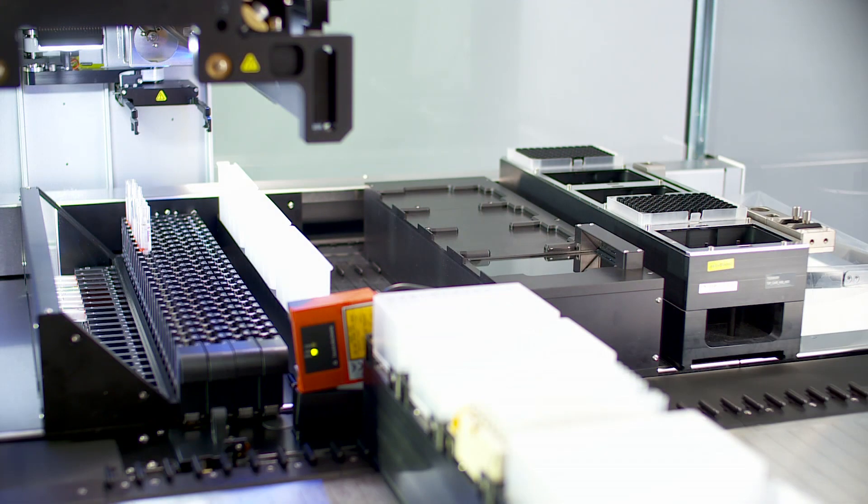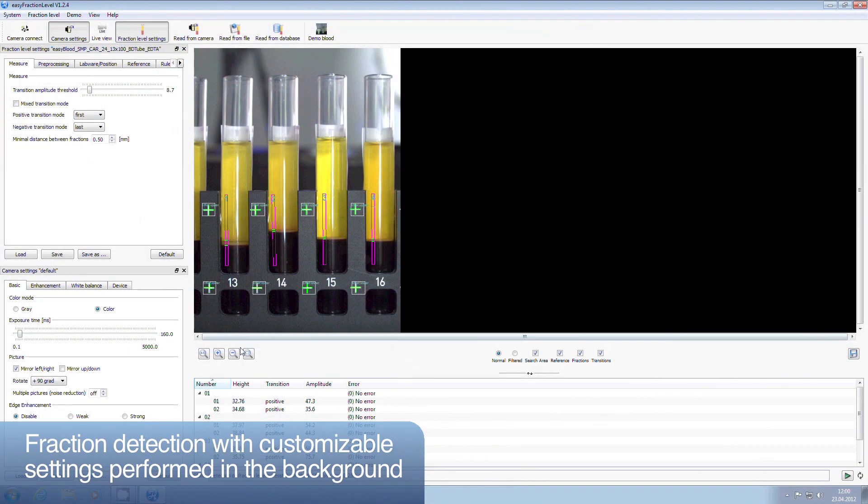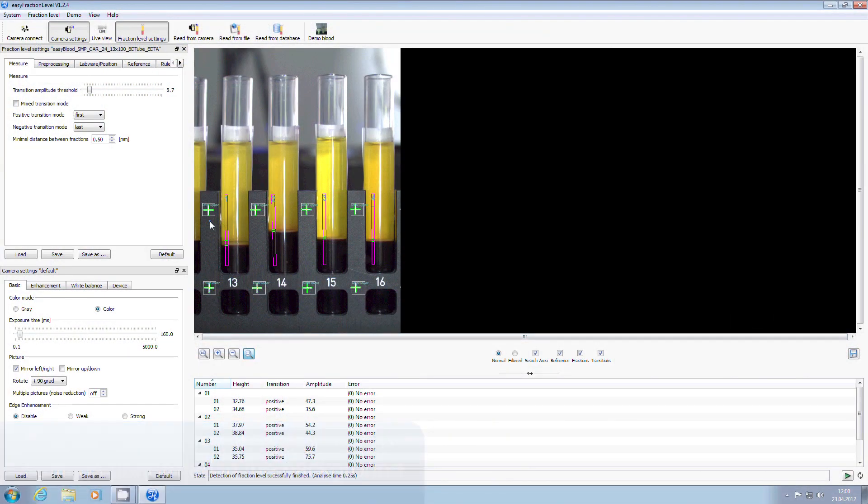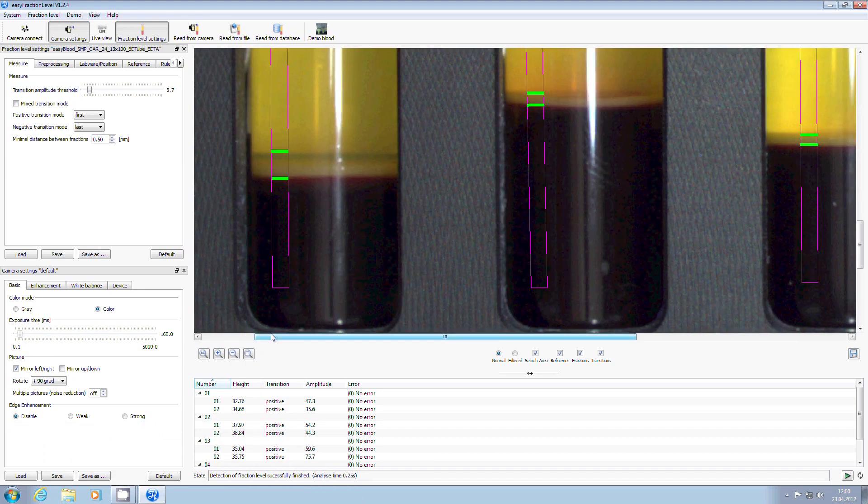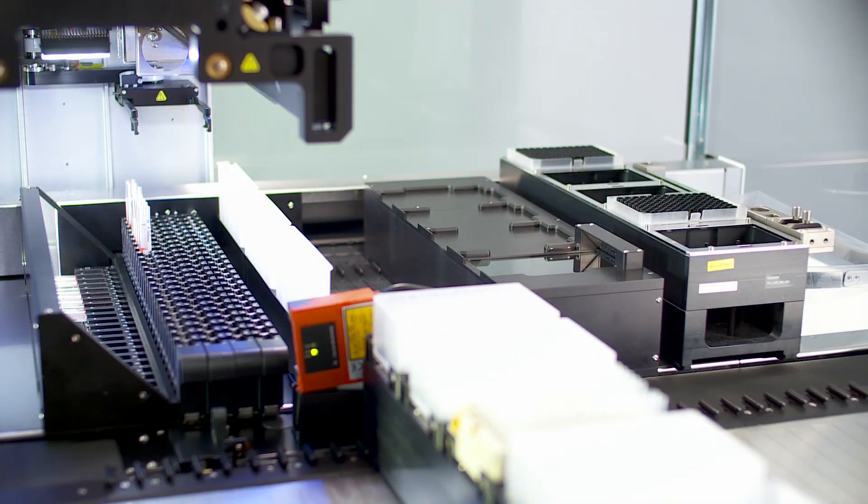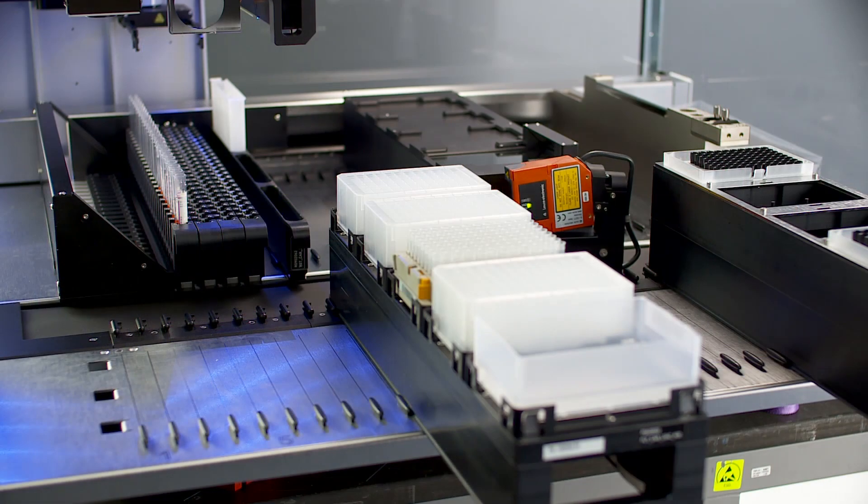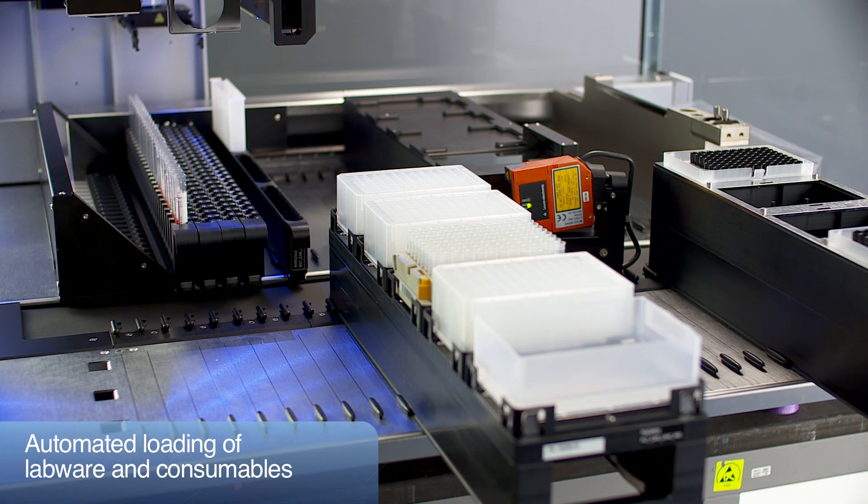The buffy coat is identified and its height stored for pipetting. An image of each tube is saved and can be sent to the LIS for complete sample tracking. Samples which do not comply with the user-definable requirements are automatically excluded from the pipetting process.